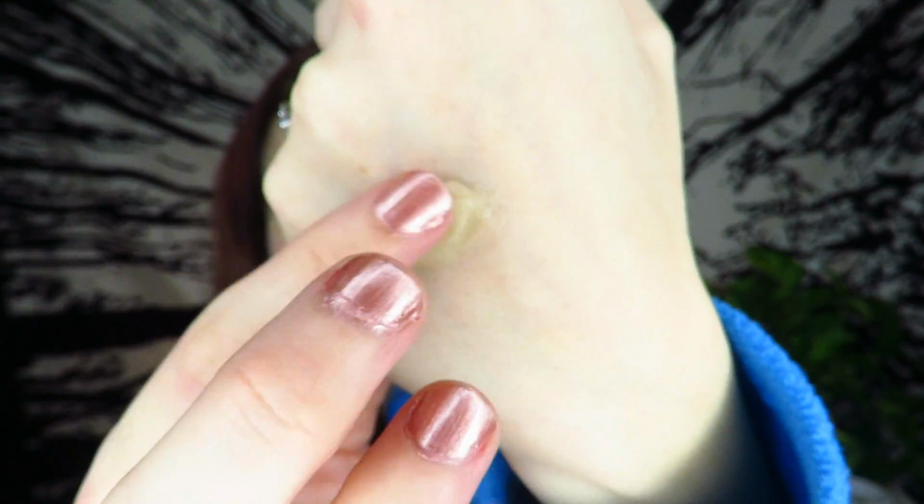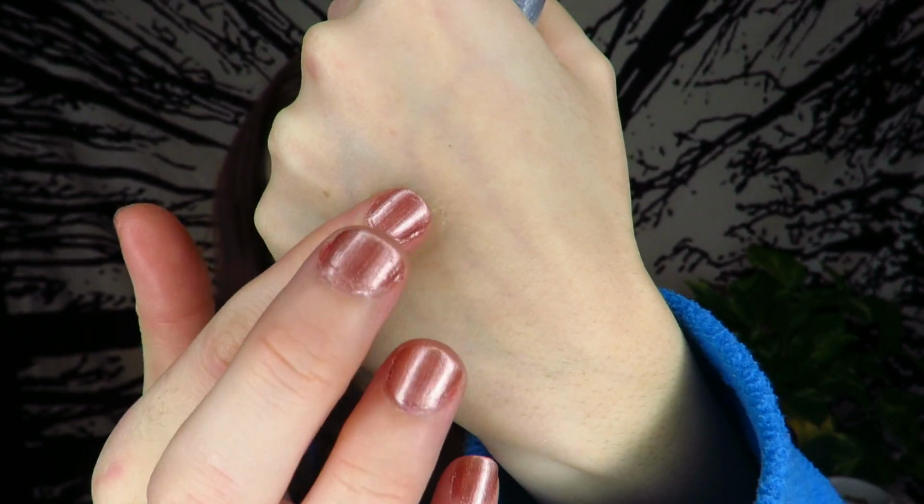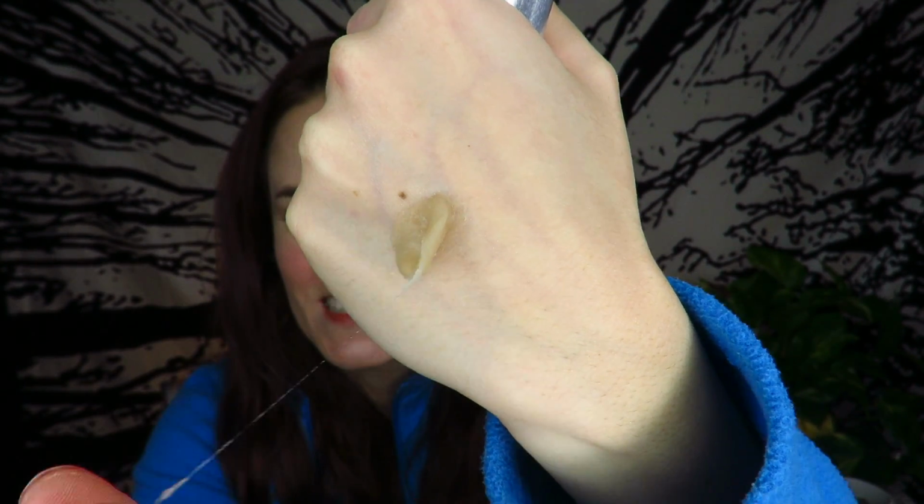but just me tapping it like that, there's none on my finger. So it's kind of nice in that regard. It's not gonna stick to your fingers too much, but you can get it onto your skin around your stoma, and you're totally fine. And then it'll stick. So that's kind of nice, see? Yeah. But now it's stuck to my hand. Gross.